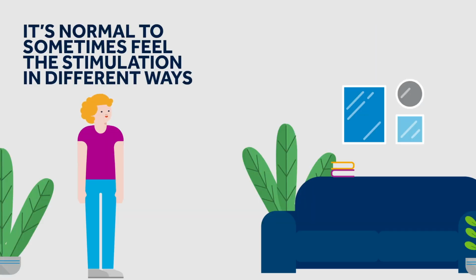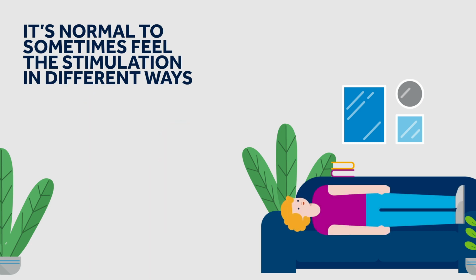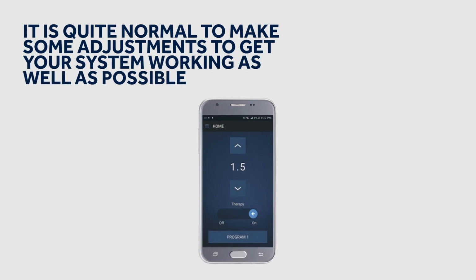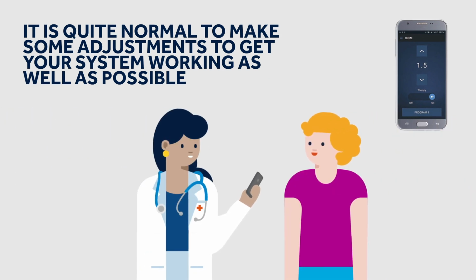What you feel from the stimulation can change based on what you are doing and what position your body is in. With the assistance of your controller and your clinical team, you will be able to make changes to how your device is working. This is sometimes necessary to optimize how your symptoms are managed.